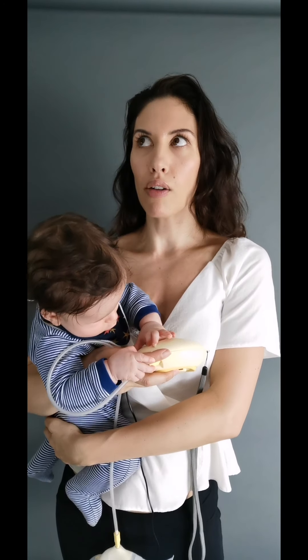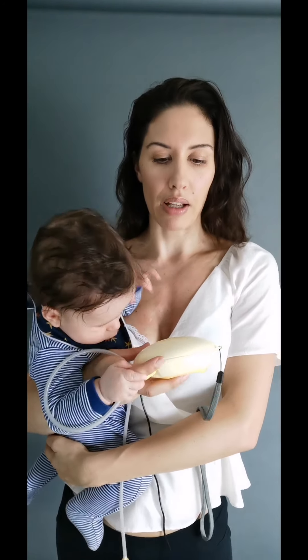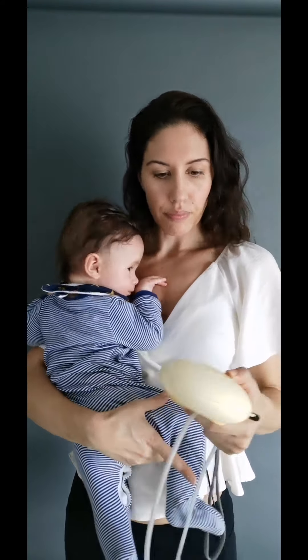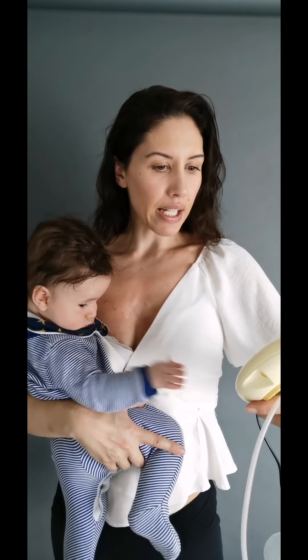Is it quiet? Obviously this is an important question if you're pumping at work or somewhere you need to be discreet. I mean, it's not silent — but I wonder if there's any pump out there that is. You'll see in my demonstration video just how noisy it is. It's not crazy loud, but it's not silent — let's leave it at that.